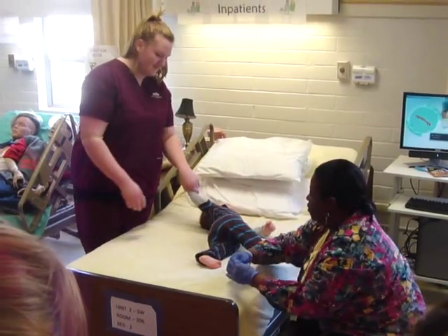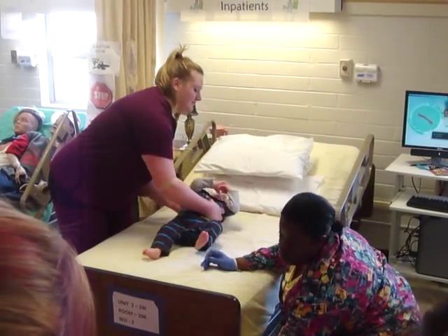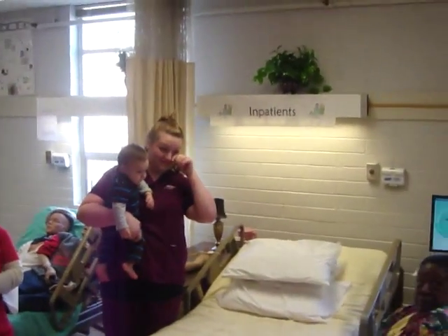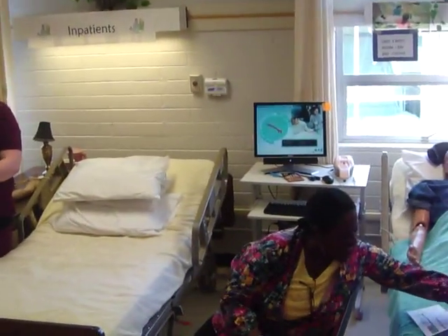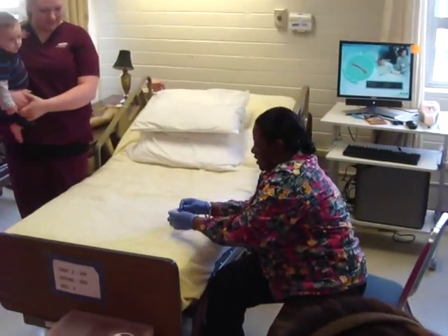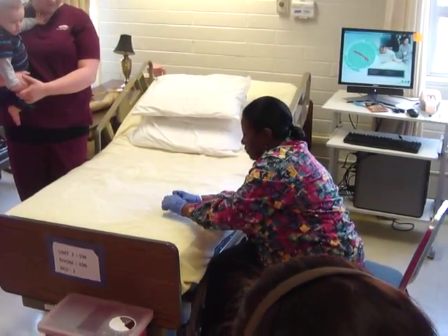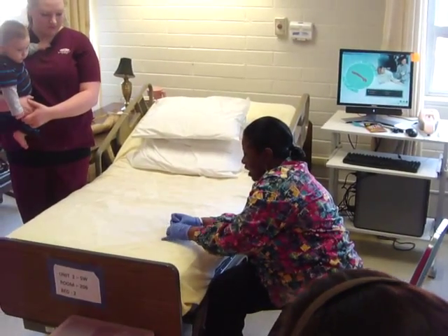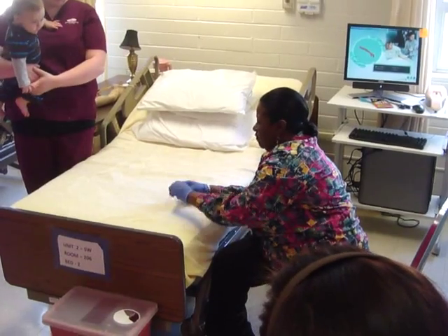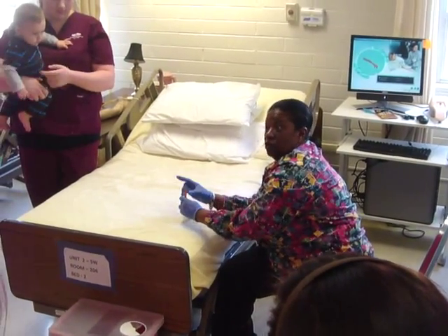We're all done. Mom, hold the baby for me — because if I turn around, I don't want anything in my way. Then I would have to cap this off because it's an open top. This would be a cap for the bilirubin.